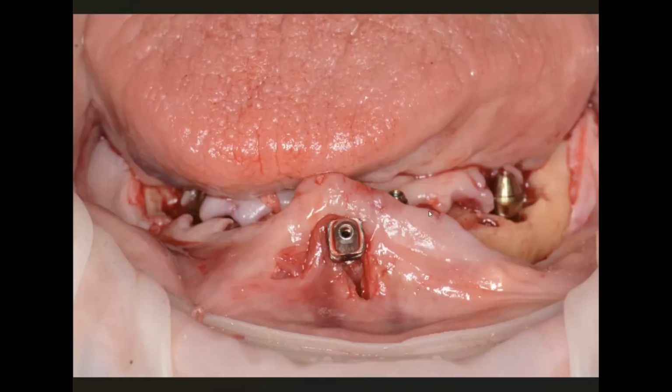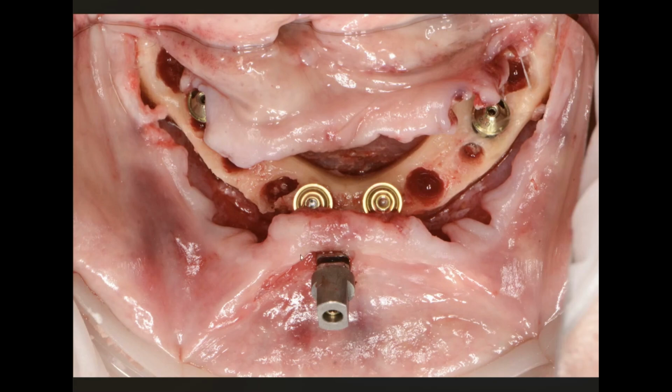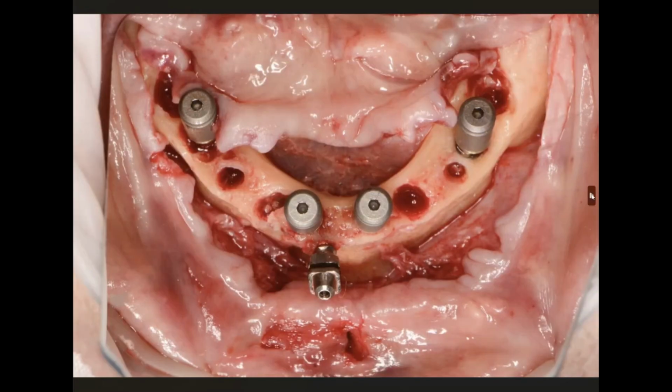And then here, this is the benefit of not doing a midline incision and releasing that for the convenience of releasing the flap. I was very careful how we elevated this flap under the flap, down the mentalis muscle to remove it and lift it over. So here I'm able to just gently lift it back over top. And then you see we're able to refix the scan body, all right? That's in the same orientation that we had it in, right? So this is here we are showing back up.